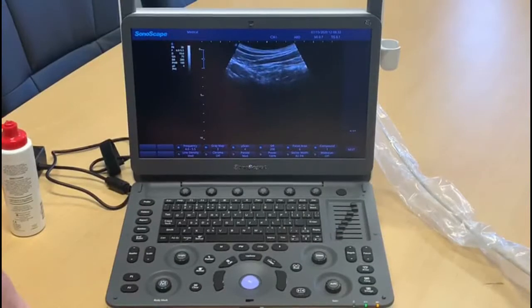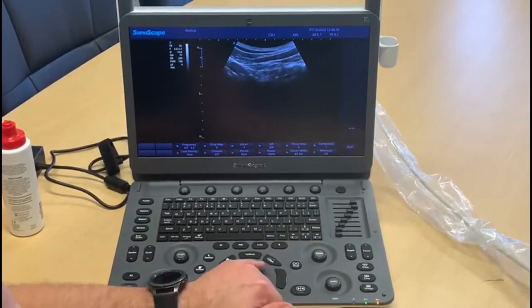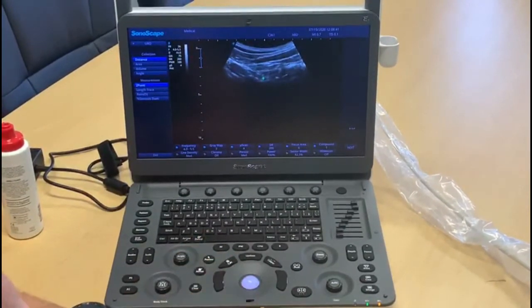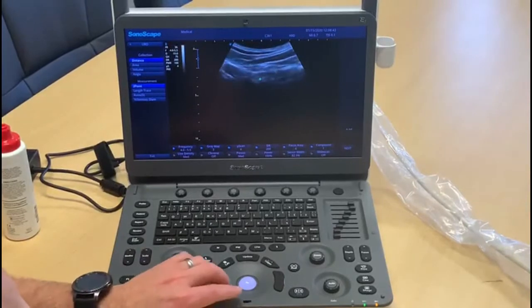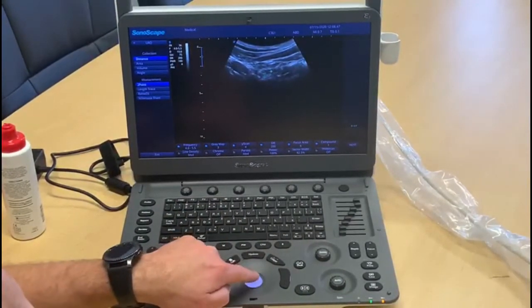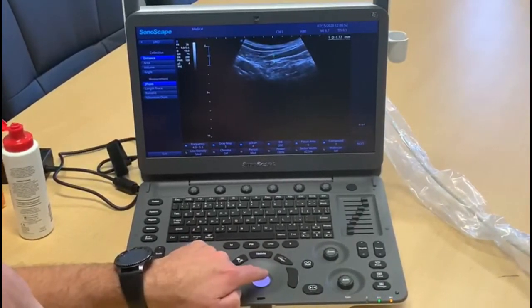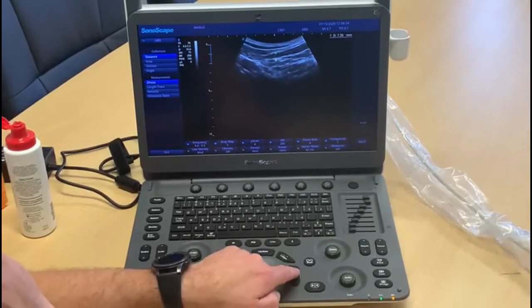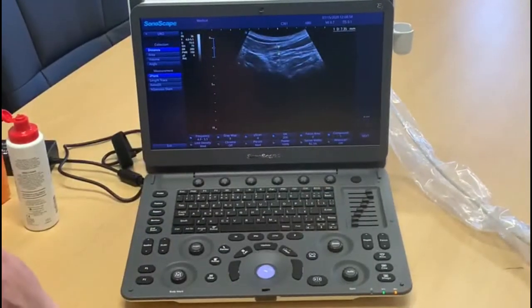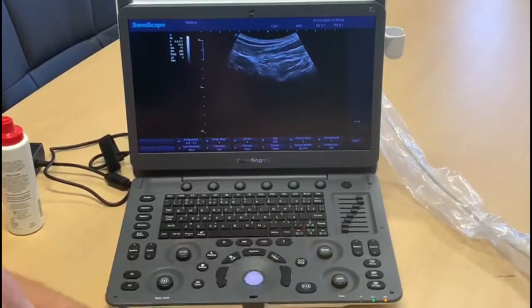Next we'll run through some measurement functions of the Sonoscape E1. The first is the caliper, which brings up a simple two-dimensional measurement you can use on a live screen. Simply press the caliper to bring up the initial measure, press the set button to pin the first point, press a second time and you'll see a measurement come up on the screen.